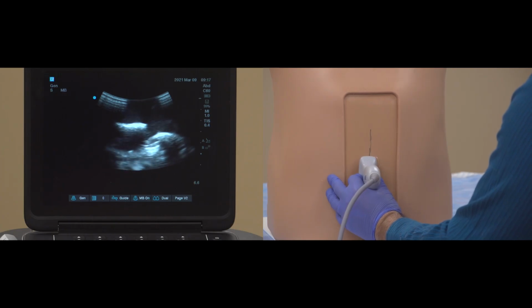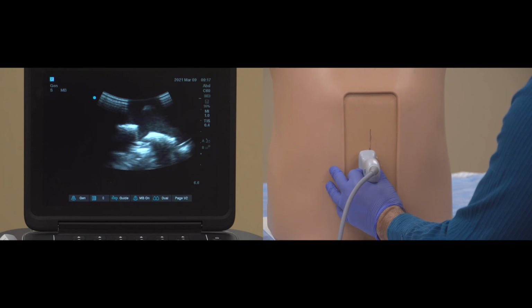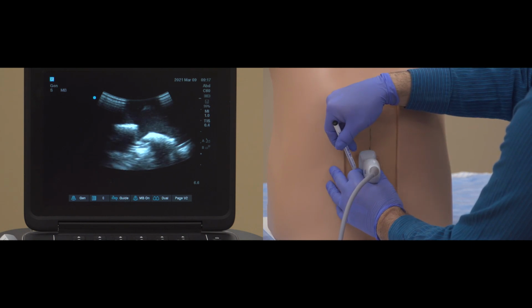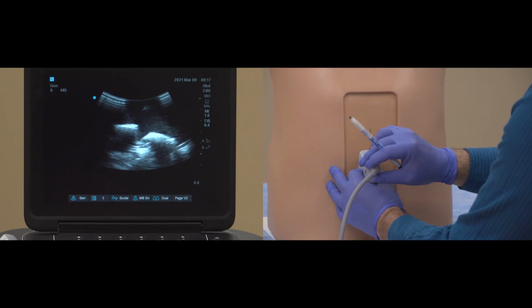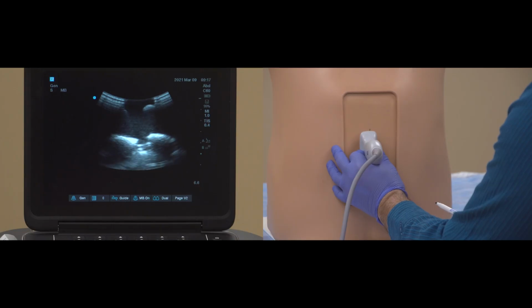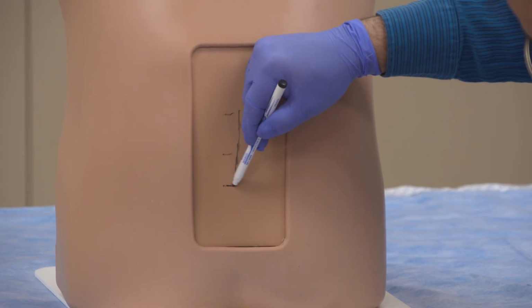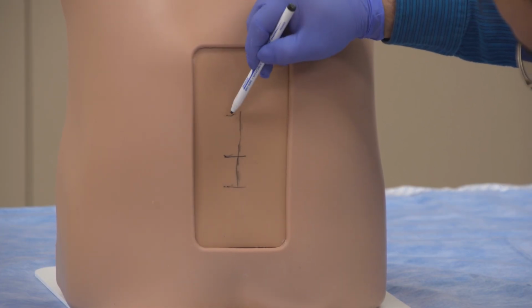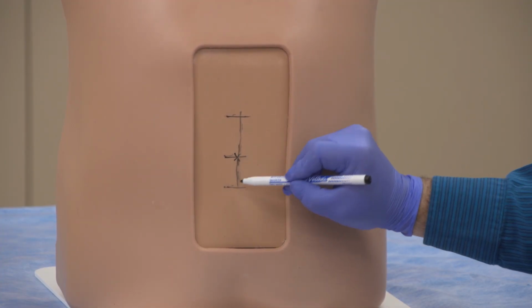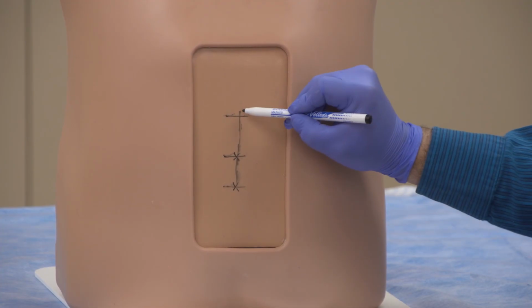Next, we will define interspinal spaces in the longitudinal axis. Place the transducer over the lowest portion of your marked midline. Identify the L5-S1 interspace. Center the interspace on the screen and then make a mark adjacent to the probe in the center of the probe. Repeat for L4, L5 and L3, L4 interspaces. Connect the marks to identify the interspaces. This gives you the center point of the interspace in the midline.